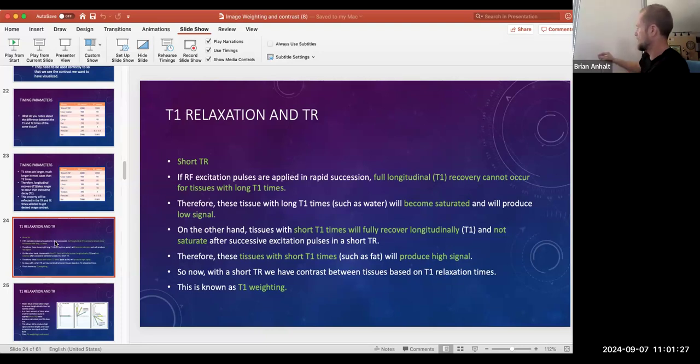Remember, I have to have somewhat of a longitudinal component before I can have a transverse component, right? So this is going to flip into this. This is only going to flip into this, right? So we need some sort of substantial longitudinal magnetization to then flip again into the transverse plane.